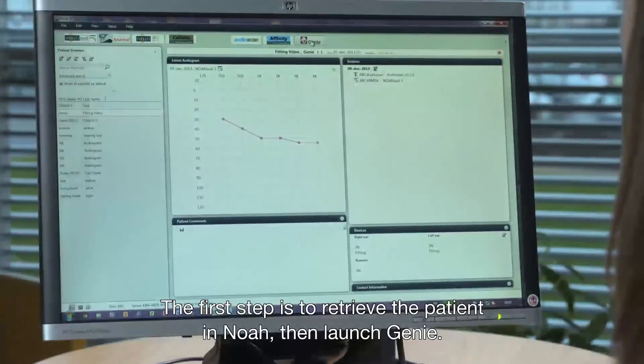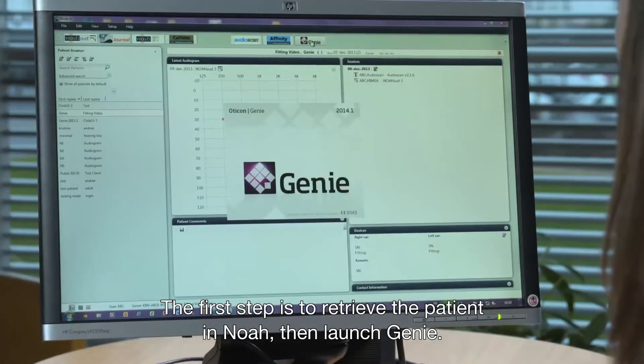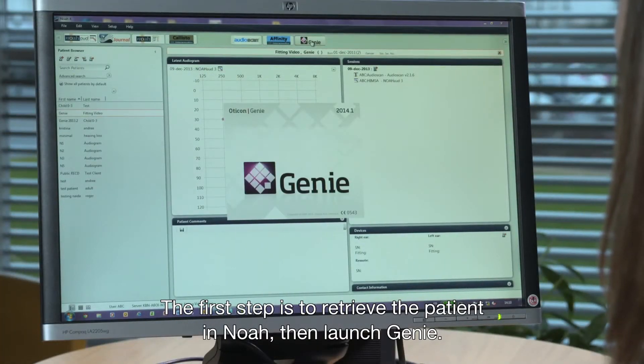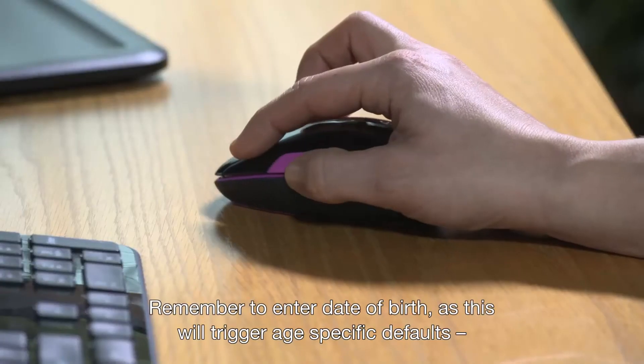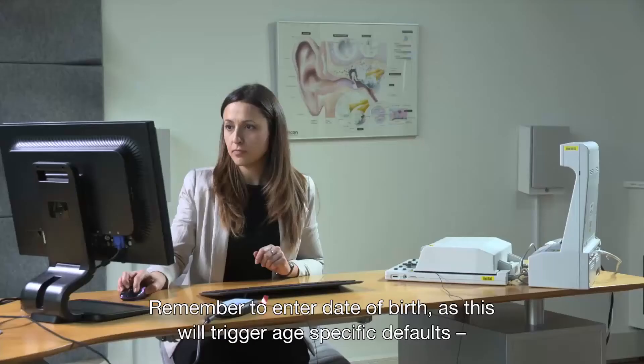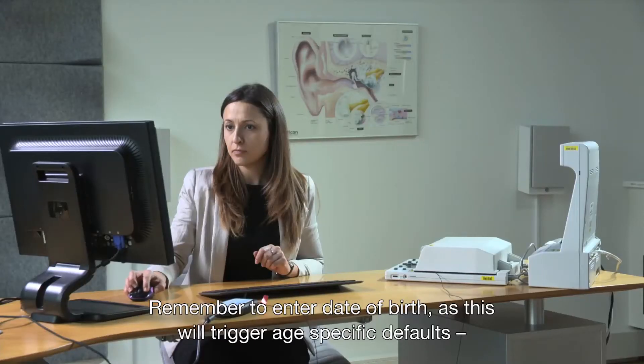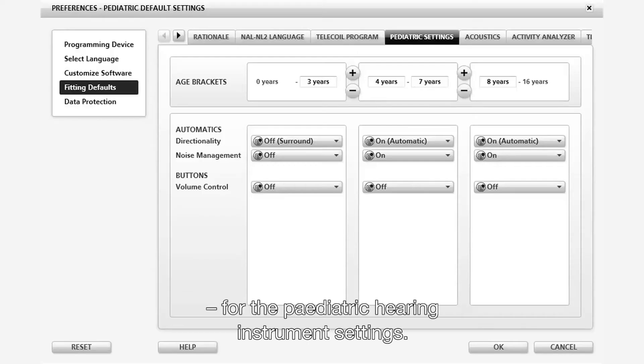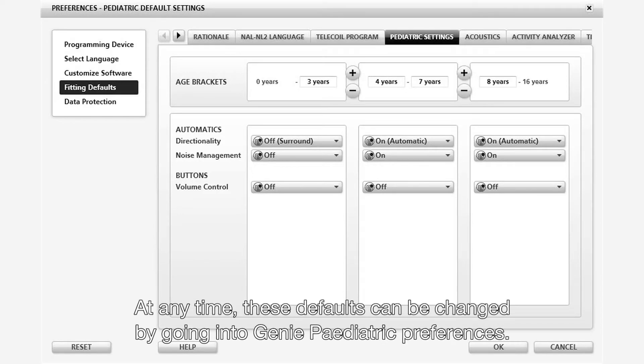The first step is to retrieve the patient in NOAA, then launch Gini. Remember to enter the date of birth of the child as this will trigger age-specific defaults for the pediatric hearing instrument settings. At any time, these defaults can be changed by going into the Gini pediatric preferences.